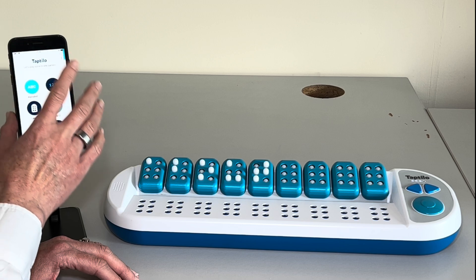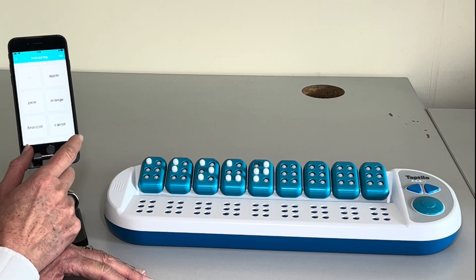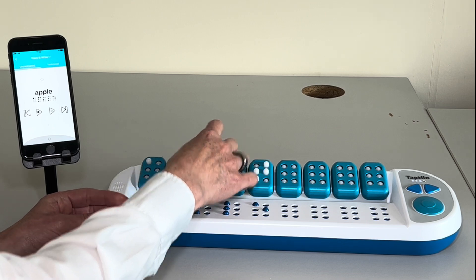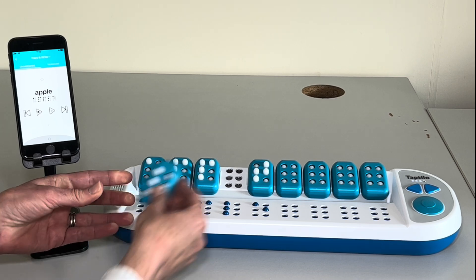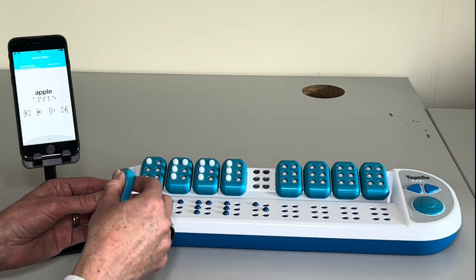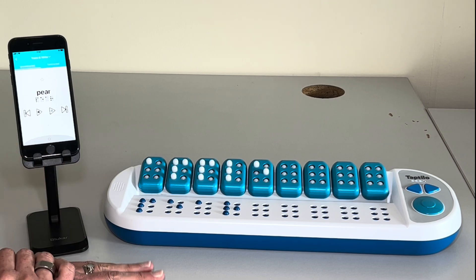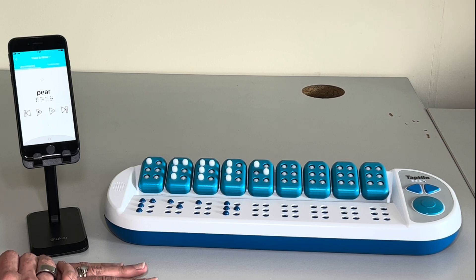Now if I go back, it resets, and I can show you my word list that I created. So I can just add words — and I can pick a word and we've got 'apple'. So I have my A there already. It's an excellent teaching aid for teachers to actually concentrate on specific objectives for their student in learning braille.